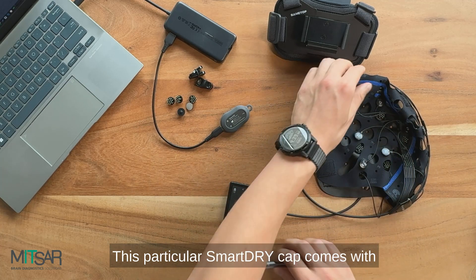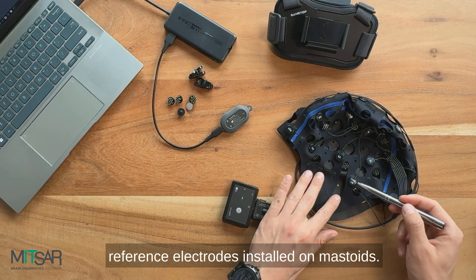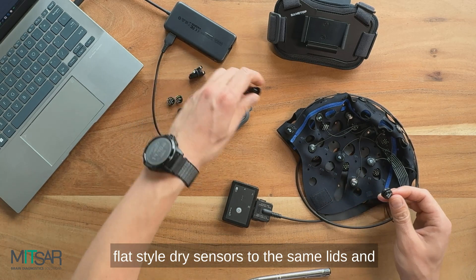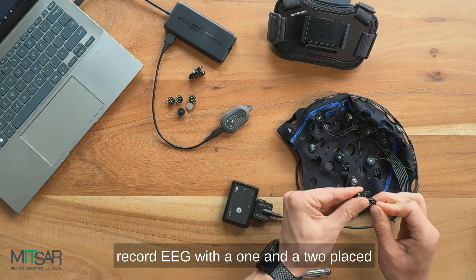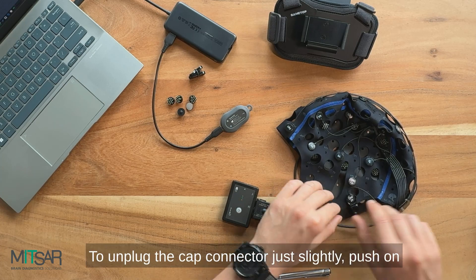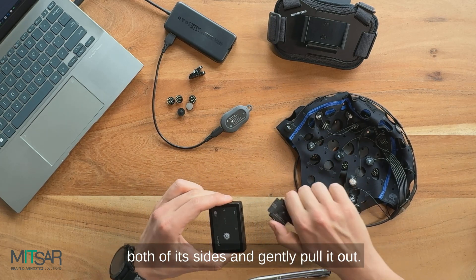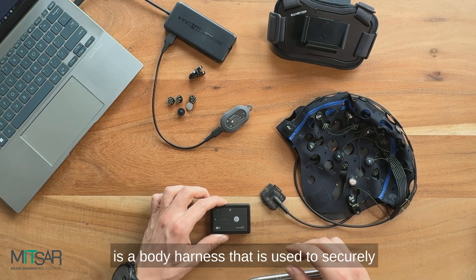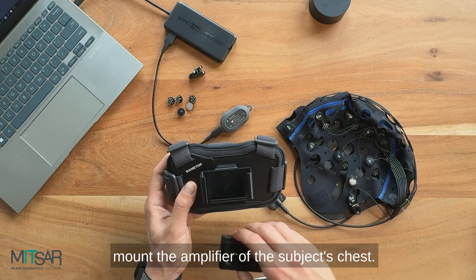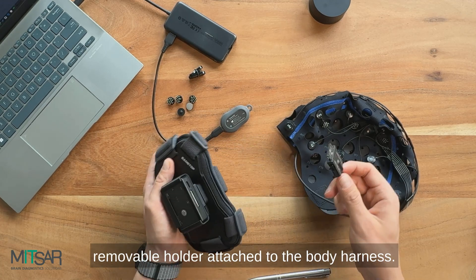This SmartDry cap comes with a common reference electrode as well as extra reference electrodes installed on mastoids, but you can also attach provided ear clamps with flat style dry sensors to the same leads and record EEG with A1 and A2 placed on earlobes. To unplug the cap connector, just slightly push on both of its sides and gently pull it out. The last part of the system is a body harness that is used to securely mount the amplifier on the subject's chest — just place the amplifier in the specially designed removable holder attached to the body harness.